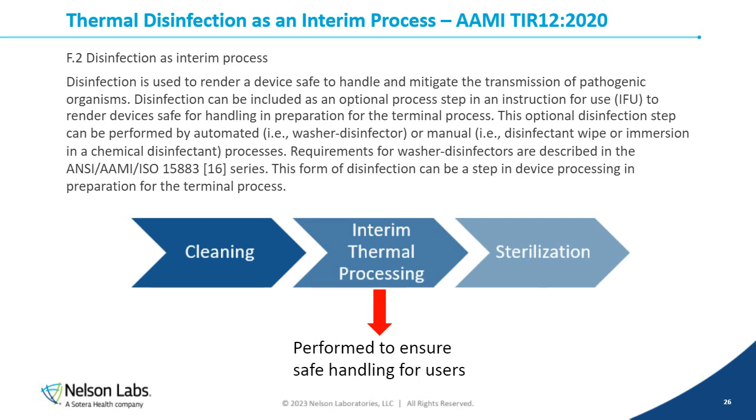It does say that disinfection can be done as an interim process to ensure that the device is safe to handle during the preparation for sterilization. So after it's been cleaned and while it's being wrapped, you can do disinfection to ensure that the device is safe to handle. That is typically done with washer or thermal disinfections. We see that pretty commonly, and we see that as a requirement coming from a lot of countries in the EU.